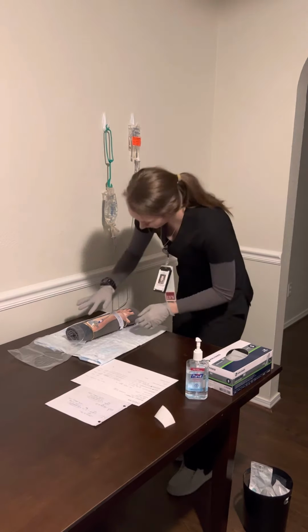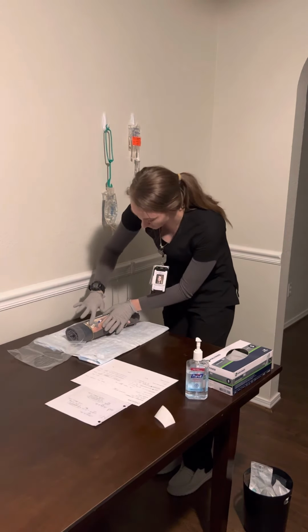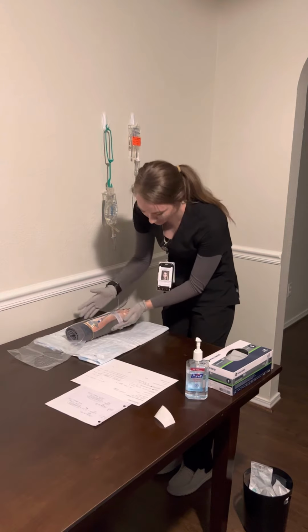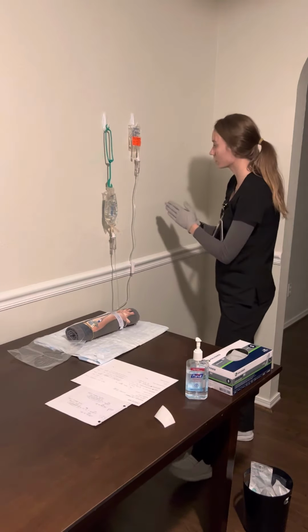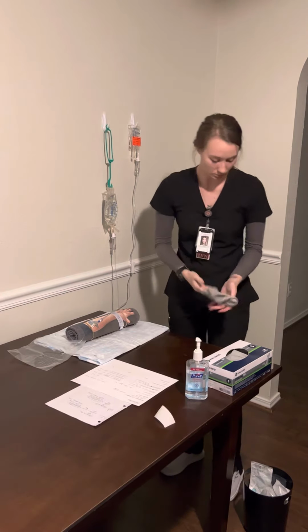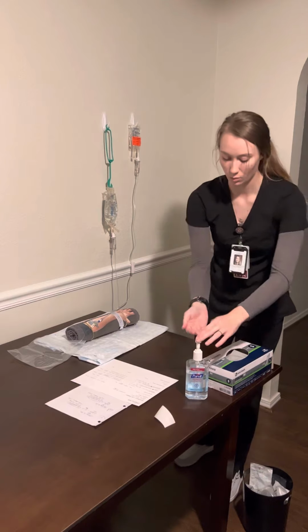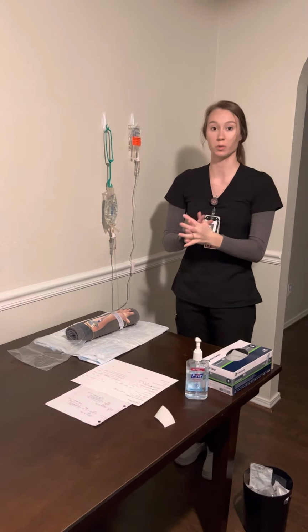And assess the site for signs of infiltration. I don't see any, I don't feel any hardness. The dressing is still clean, dry, and intact. We are still flowing good. So I'm going to remove my gloves and wash my hands, and then I'm going to ensure proper documentation of both of these fluids.